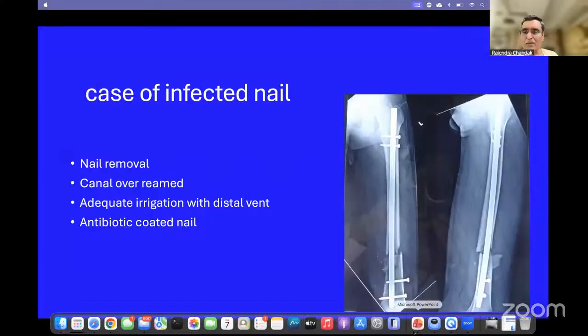Rupesh, Nandkishore. 6 weeks down the line, fixation was done with the intramedullary nail femur. Good evening, sir. There is a gap at the fracture site, yes, and there was a loosening of the distal interlocking bolt. Agreed, totally agreed. The good findings you have shown. You can share that X-ray, Rajendra. Yeah, I'll share it again. Able to see the X-ray?